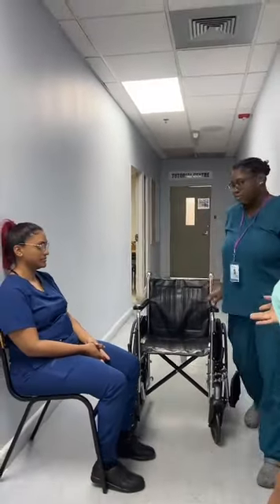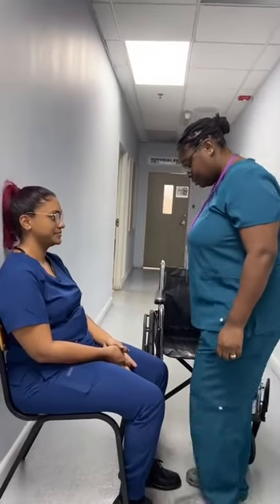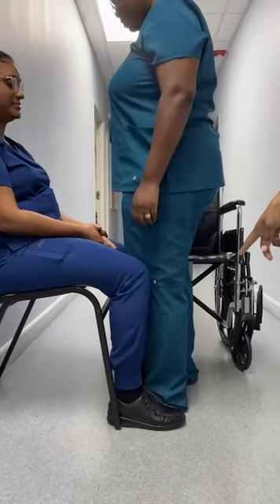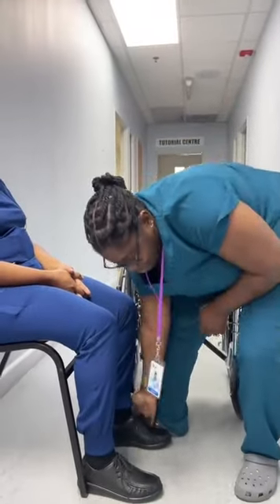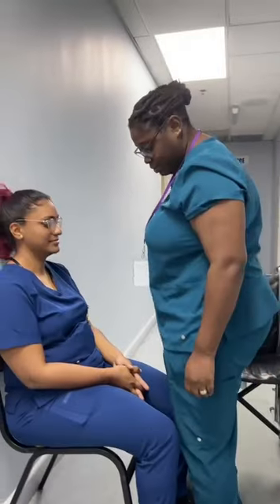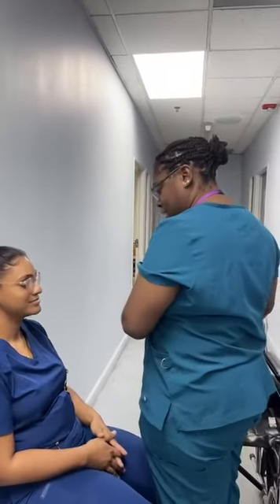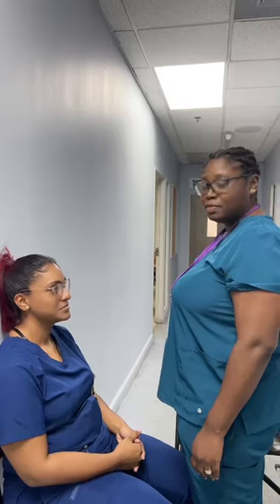When assisting the client, our assistant needs to ensure that she applies proper body mechanics. She also needs to ensure that the client has on the correct footwear, non-skid footwear. It's also important to let the client know what you are about to do. Now that she understood, she will proceed to place her into the wheelchair.